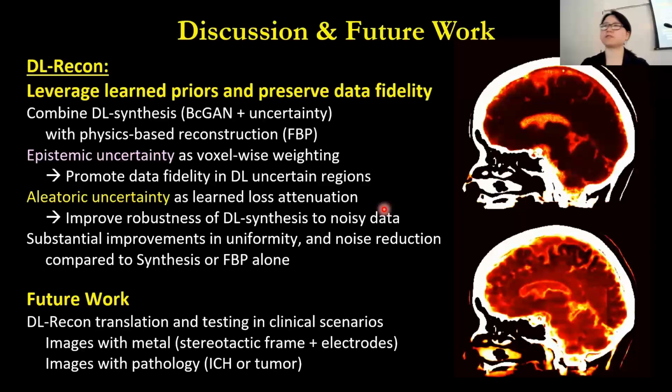Thank you for the question. I think we can definitely change the input to the corrected FBP, like the fully corrected FBP we have. But we want to exercise the network a little bit by not just making it a noise reduction network. And when you say we need a corrected FBP, what kind of correction are you talking about?